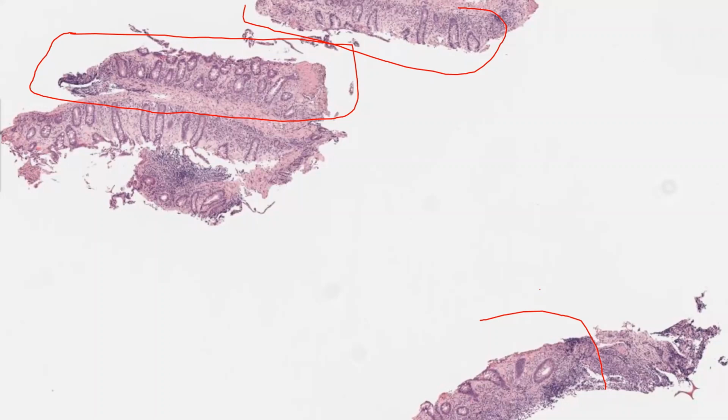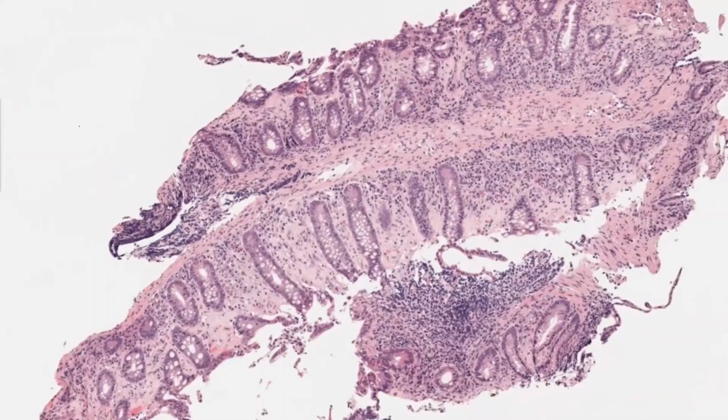For the second part, yes, I think the epithelium looks stripped in some parts of the biopsies. And let's take a closer look. It's pink lamina propria. Yes, it is pink lamina propria. We agree with this, and I told you that this is not the right color of the lamina propria. You can see the gradients properly now. The gradient is reversed.